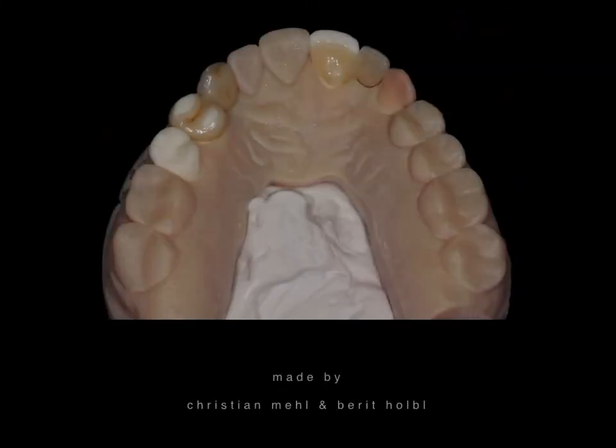You can see really a lot of color-taking pictures, but it helps, as you'll see at the end. Then we prepare the tooth after giving some small local injections, take a digital scan, print a model, and mill the ceramic out of one block — just colored, no veneering anymore. The techniques have really changed, and on the model already it looks quite wonderful.